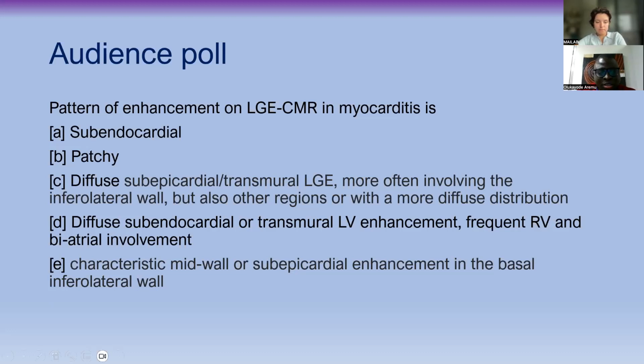So what is your answer? Which one will you spend money on? I'm waiting. Think about it. It is what we talked about. We saw patchy, subendocardial. Should I give you a clue? Okay. It is one of the diffuse subepicardial.